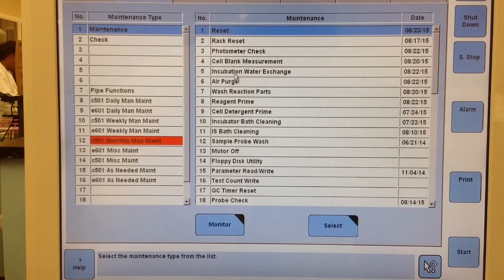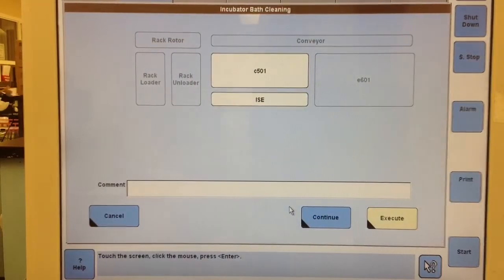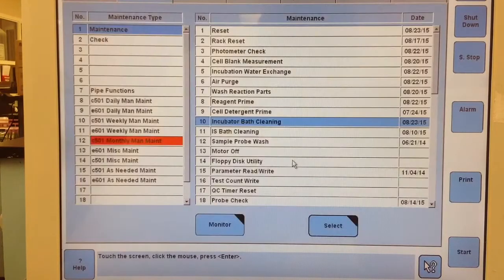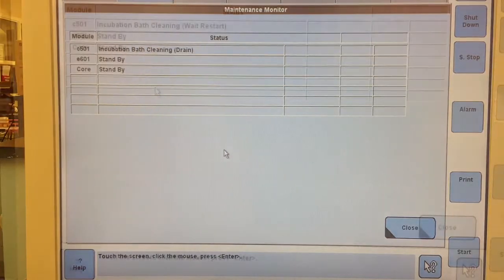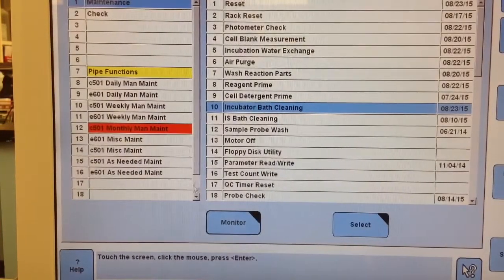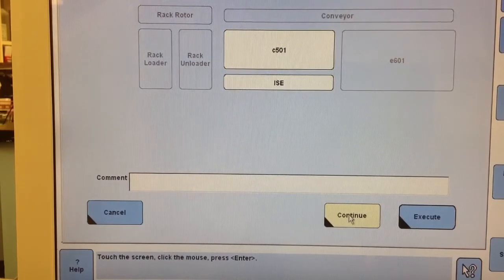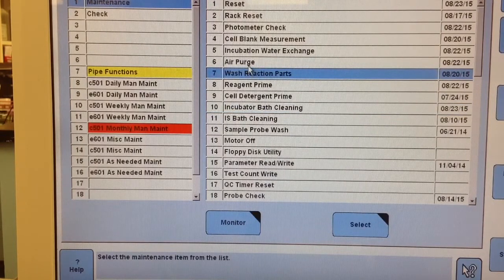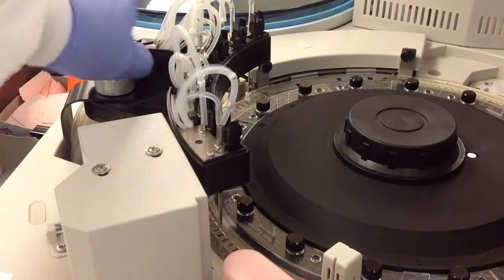To start the incubation water bath cleaning, you need to select incubator bath cleaning and execute it. This will drain the water from the water bath so you can get in there. It's important to keep the cover closed before you can start this. Go ahead and execute it. You can monitor it in the 501 - it's going to go from incubation bath cleaning, draining to wait restart. Once it goes to wait restart, the next thing you'll be able to do is hit continue after the reaction cells are back in. That'll refill the bath, and then you're going to have to perform wash reaction parts and a cell blank measurement before you move on to using the analyzer.